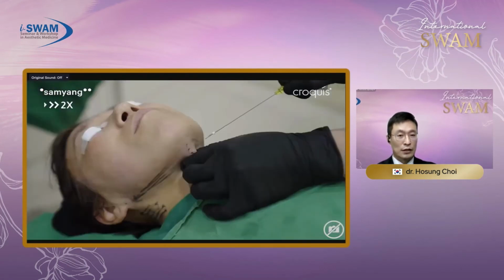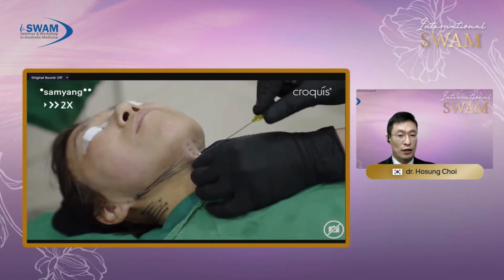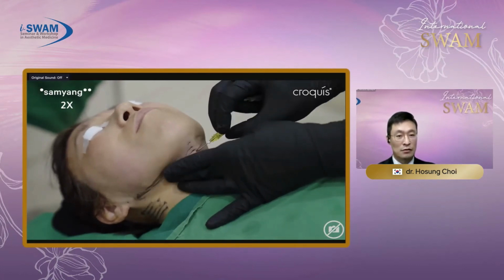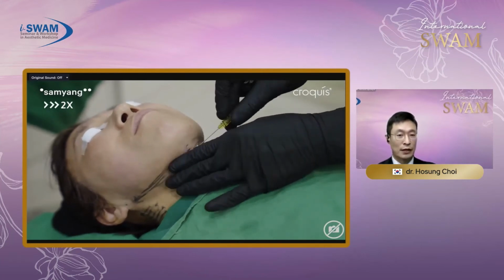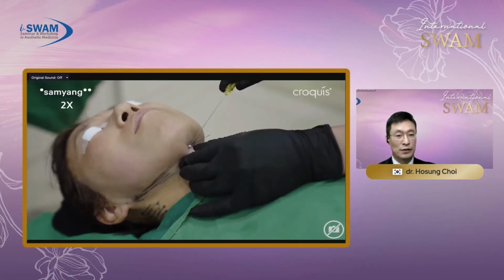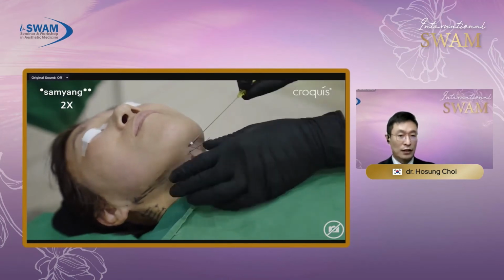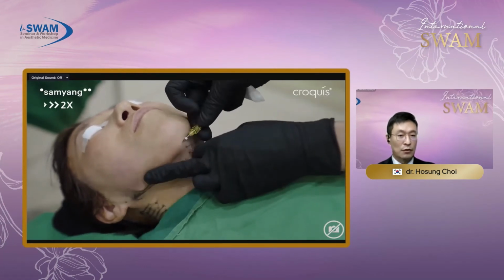So if you insert the cannula too superficially in the beginning, then after tying the knot, there may be some skin dimples at the entry points. And sometimes it's not easy to resolve these dimples. So initially, go vertically, and then go horizontally.